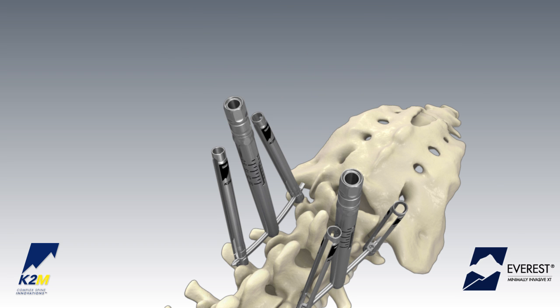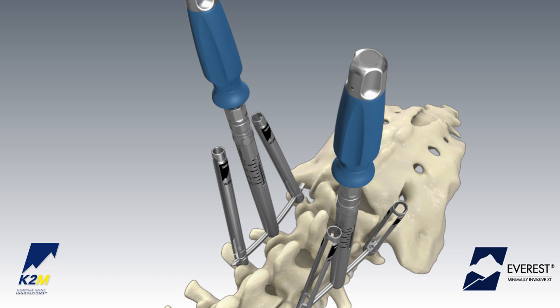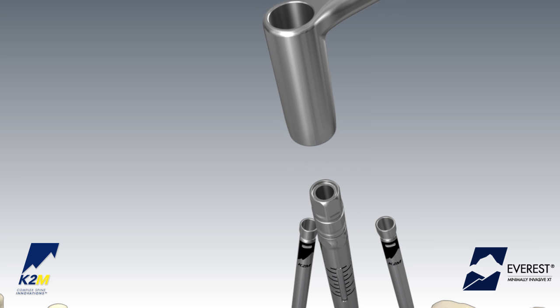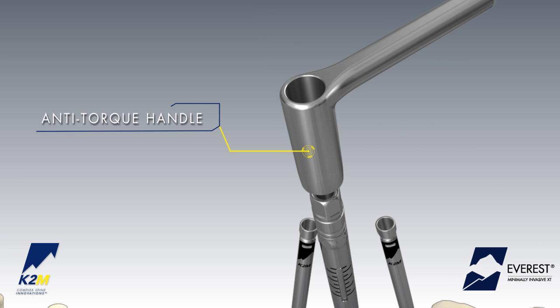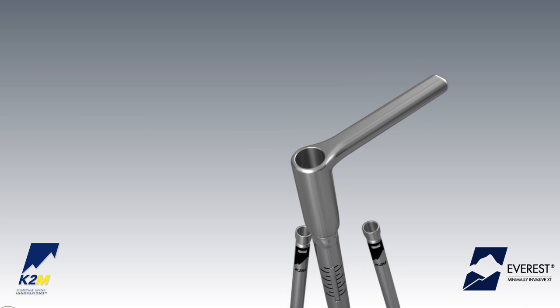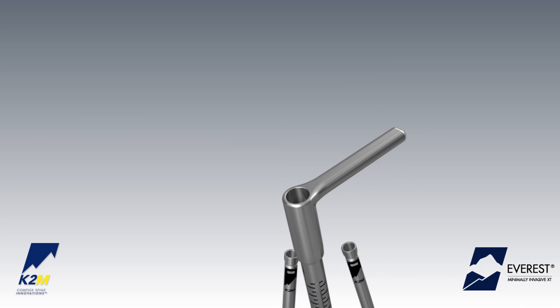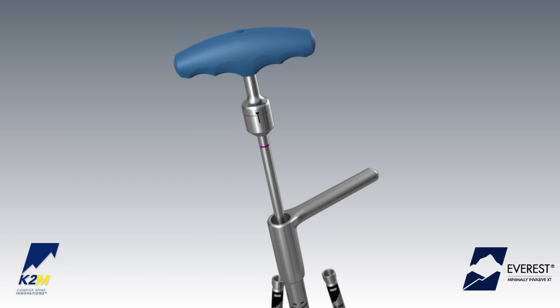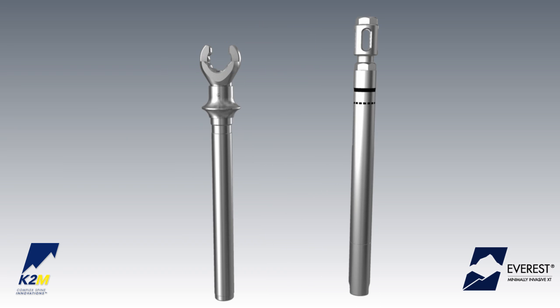Attach the set screw to the split-tip provisional driver and insert it into the cannula of the tab reduction tunnel and into the implant housing. The tab reduction tunnel can be used to final tighten the set screw with the use of the anti-torque handle. Slide the anti-torque handle over the tab reduction tunnel until it is properly seated, then place the torque-indicating wrench down the cannula of the tab reduction tunnel.